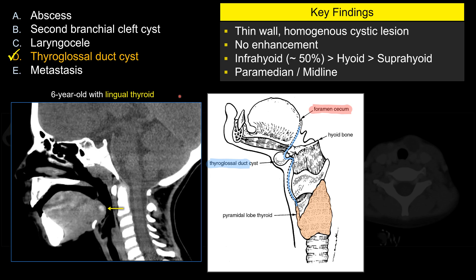Because of that development, sometimes you can see cases like this: a six-year-old child with a round hyperdense lesion at the tongue base at the level of the foramen cecum. The patient incidentally has an ultrasound of the thyroid gland showing lack of proper development of the thyroid gland. This lesion is hyperdense even before contrast — remember, the thyroid gland is dense before contrast. So the patient actually has a functional thyroid at an aberrant location, which in this case at the foramen cecum is a lingual thyroid.